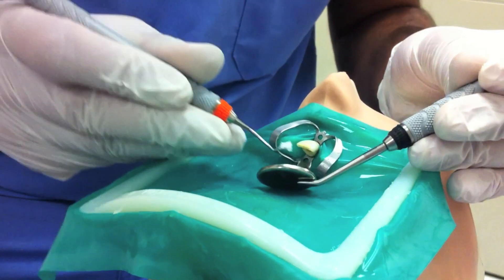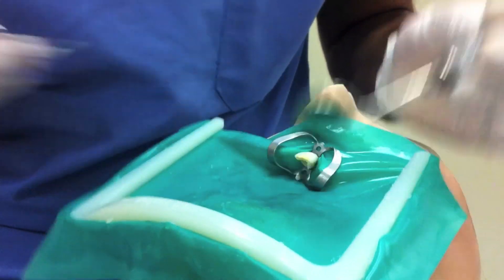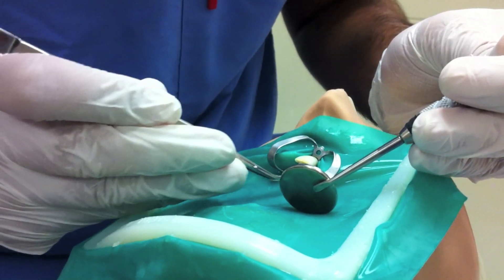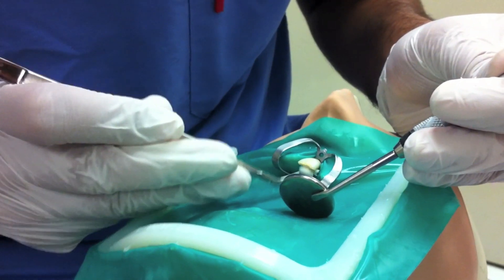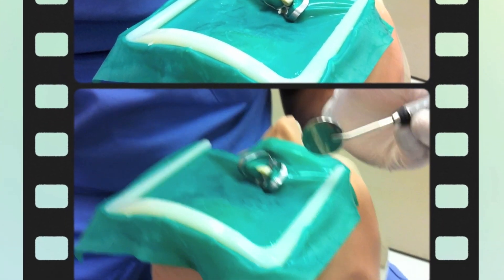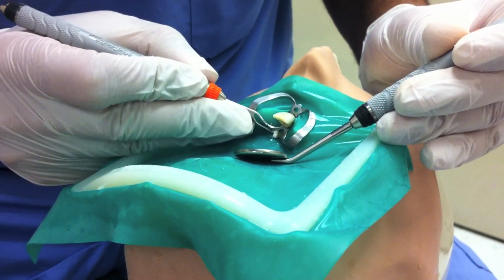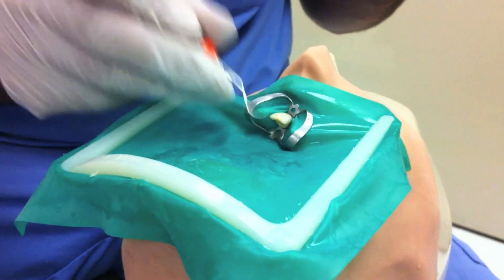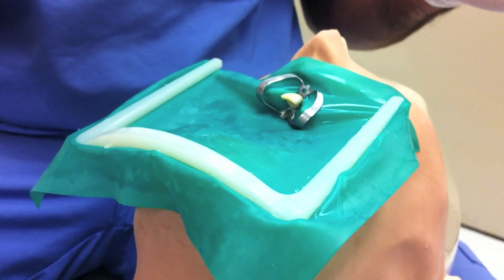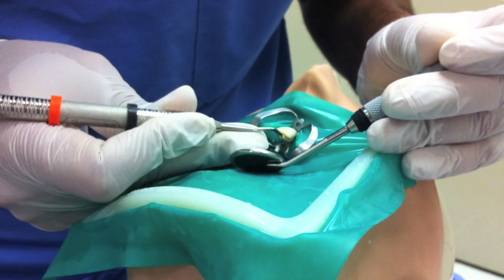The pulp chamber is then packed with the paste. Excess liquid is removed by tamping with a cotton pellet, which also compresses and pushes the paste into the recess. Excess oxidizing paste is removed from undercuts in the pulp horns and gingival area with an explorer. A thick mix of Cavit is packed carefully to a thickness of at least three millimeters to ensure a good seal.